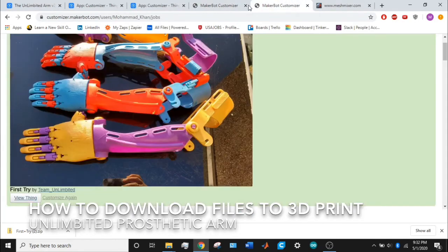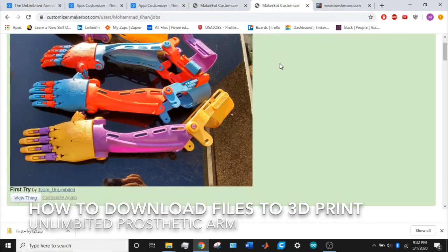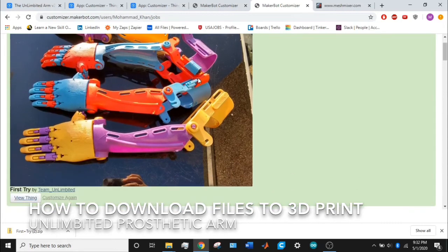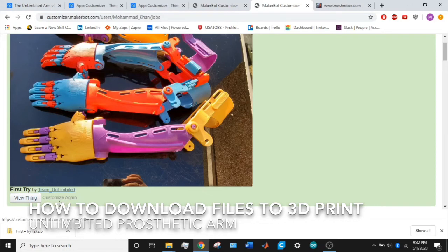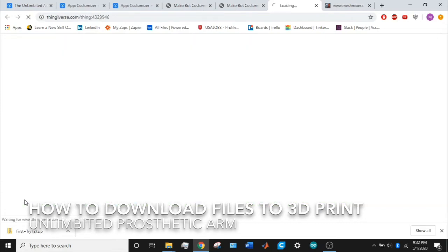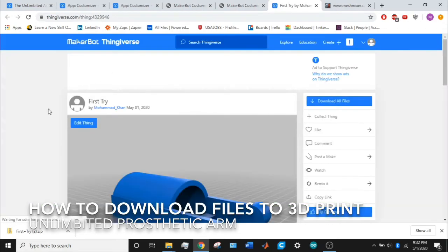Your queue will look like this. There'll be a progress bar right here. I did one and it was finished in less than seven minutes. Once you're done, just go to the bottom of the photo, go on view thing, or you can customize it again if you want. If you made a mistake in the measurements, you can fix it. But if you're good to go, click on view thing and another tab will open.